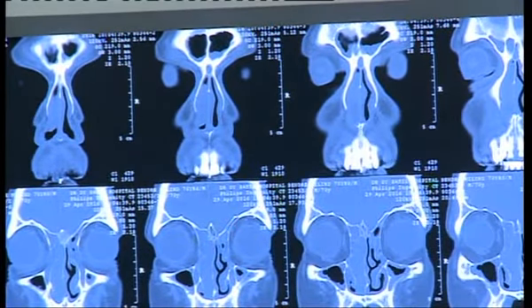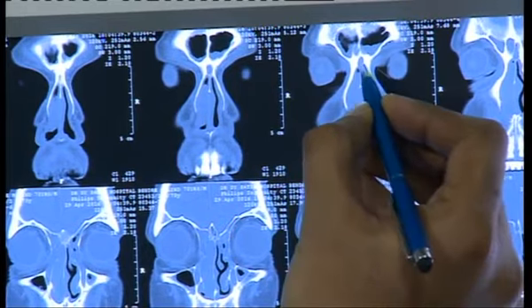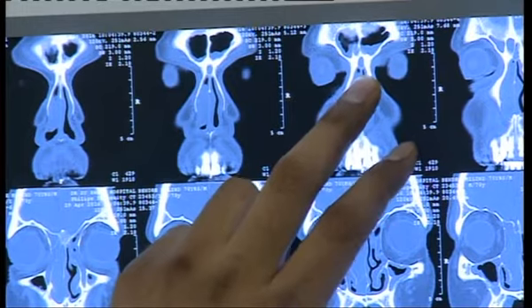Now, moving further behind, see what you see, the swelling of the septum at this level. This is the septal body. That's the natural appearance of the septum over here. Now you look at the interfrontal sinus cell, what I am assuming.